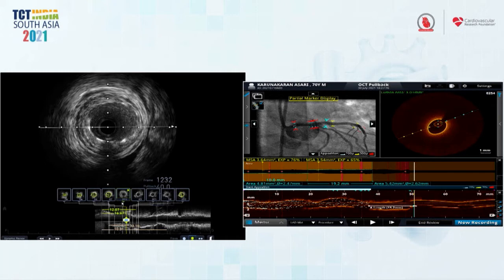I would be pretty comfortable with those numbers. But obviously, you should do what you're most comfortable with. This was just a suggestion from my point of view. If you look at the longitudinal image, the left main is not perfectly flush. You can see it's at an angle. So your 15 millimeters may actually end up quite favorably, touching the proximal segment of the aorta and distally sticking out a few millimeters.